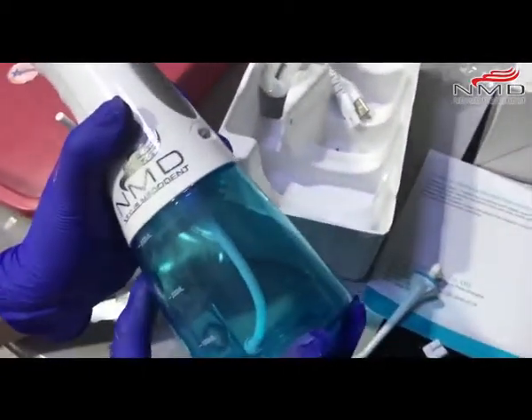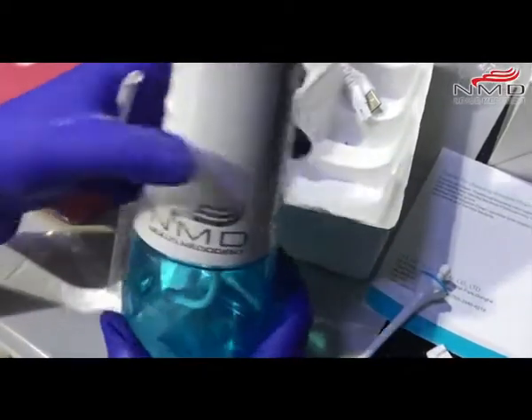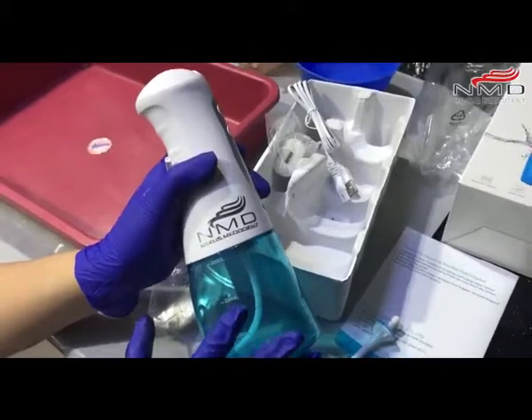This is the water container — the water tank basically. This water tank has a 220 ml capacity.